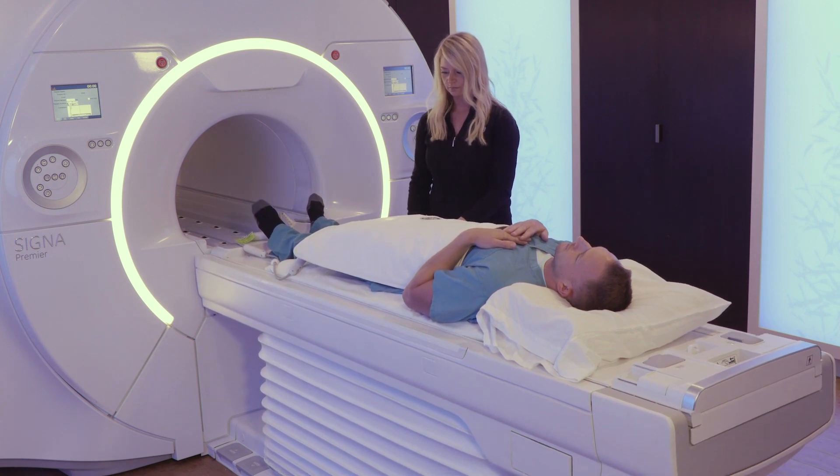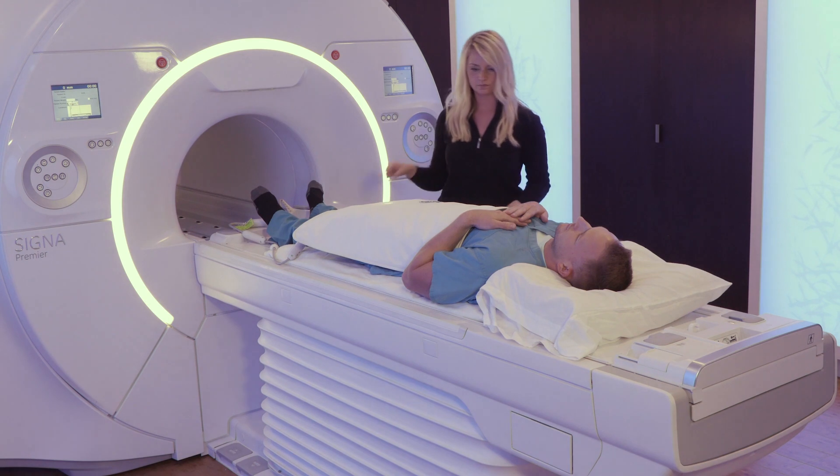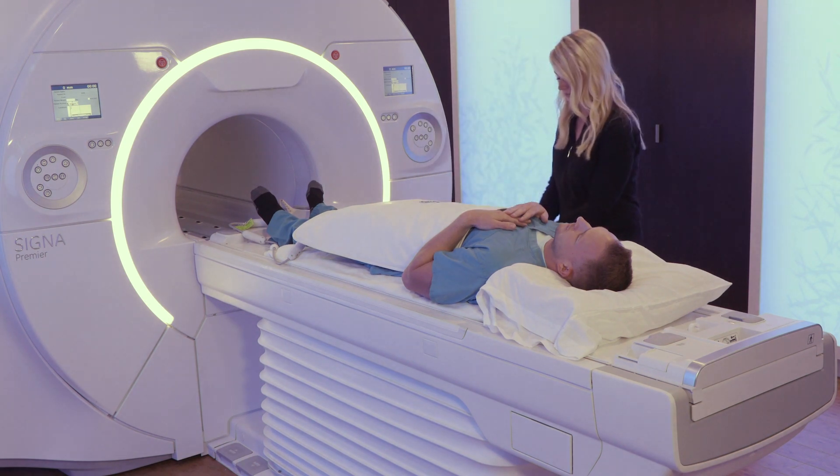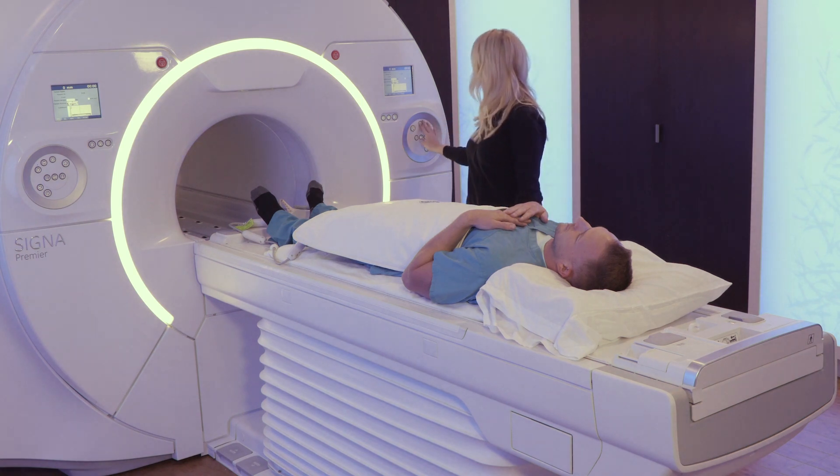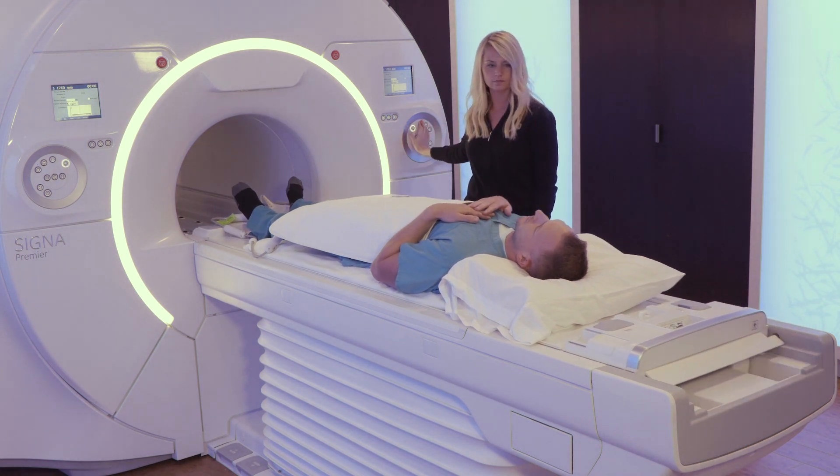As with any MRI exam, be sure to use proper padding. Use the IntelliTouch Strip to do a quick and easy one-touch landmark of the patient. And now you're ready to scan.